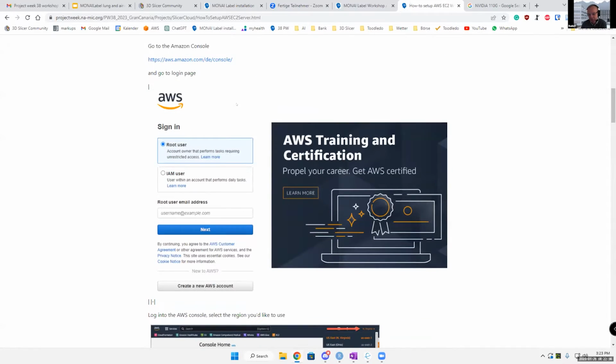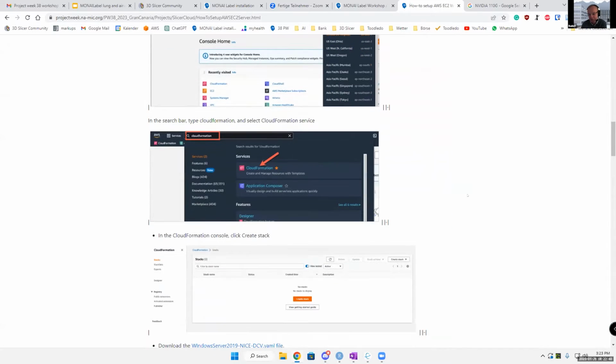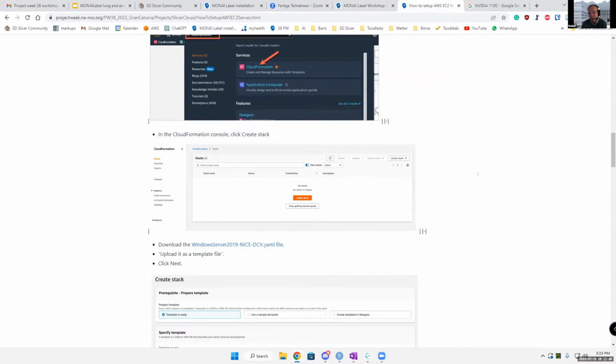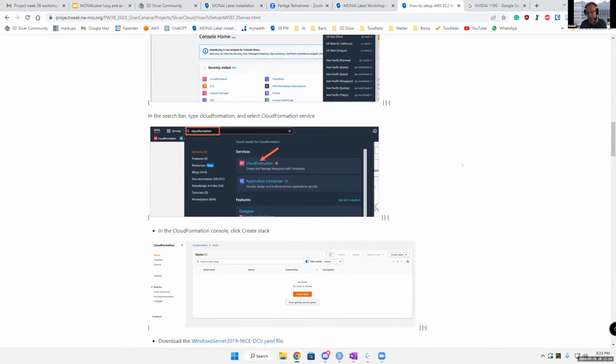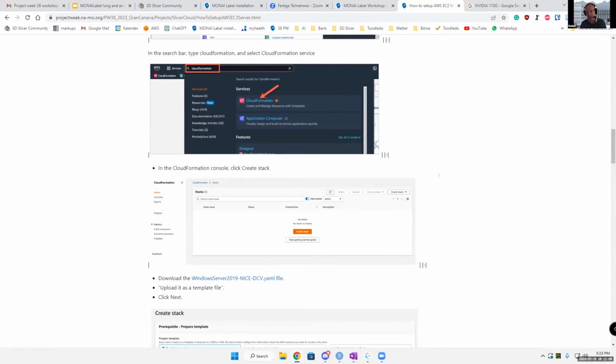And then you have to wait for 20 minutes, and after that you will get your own EC2 Windows instance, which can be used on and off and can be upgraded and downgraded. It's not the purpose of using it at this workshop here, but it will be helpful if you use 3D Slicer in different clinical surroundings or while you travel.